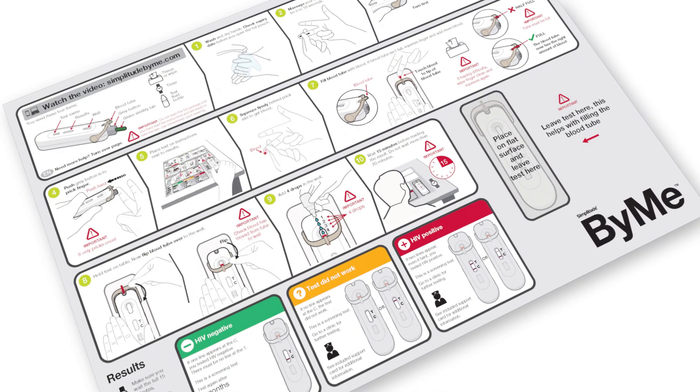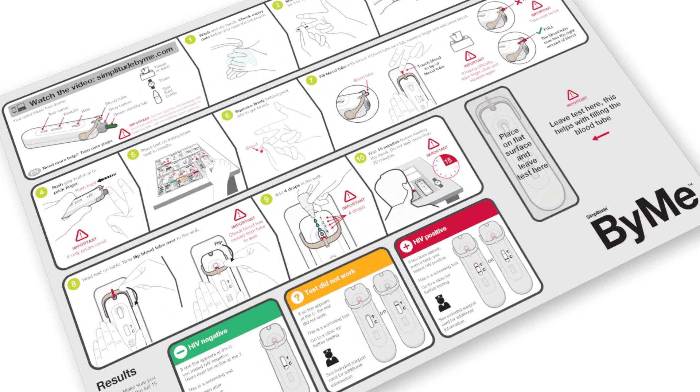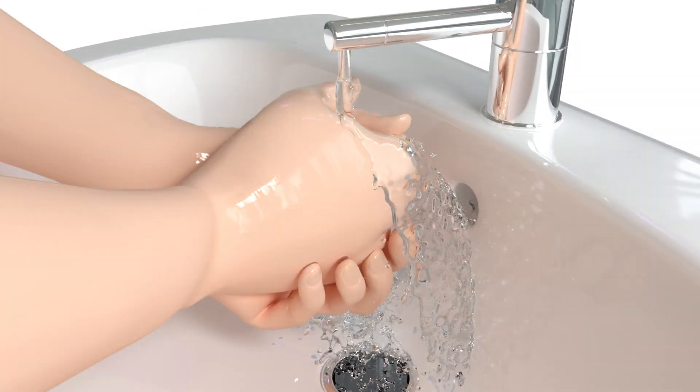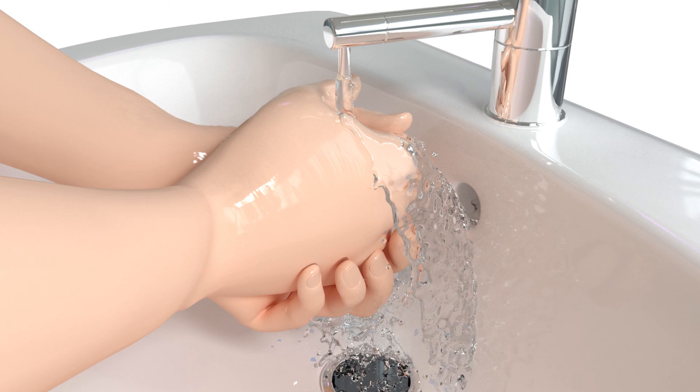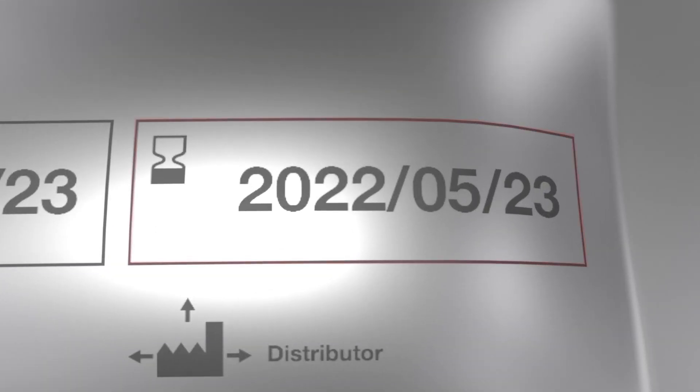Before you start the test, unfold the instructions and read them carefully to get familiar with the testing process. Then wash and dry your hands to make sure they are clean. Before you open the foil pouch, check the expiry date to make sure it is still current.